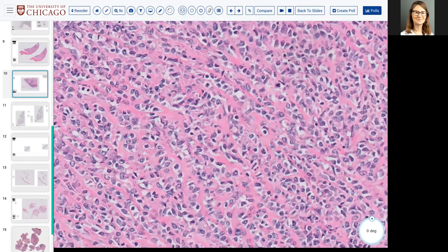And so sclerosing epithelioid fibrosarcoma is positive not only for MUC4, but also for EMA, yeah. Yep. So when I'm evaluating these types of tumors, I generally do both because sometimes EMA is not so great. MUC4 is generally excellent. And really, when you have MUC4 staining in something that you have really proven cannot be anything else, it's very helpful for these types of diagnoses because MUC4 is positive in very few things.